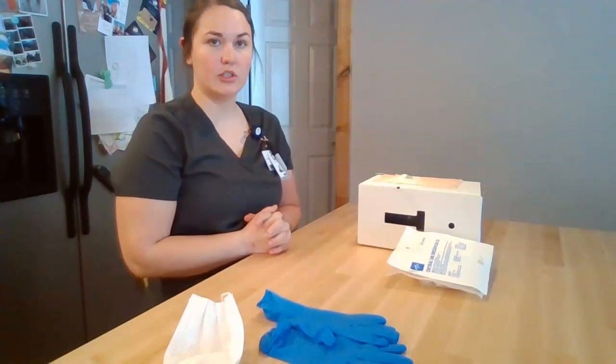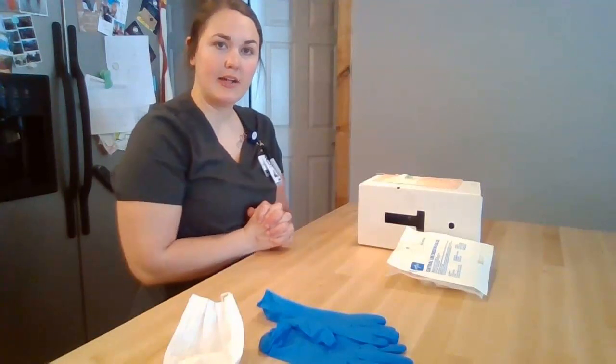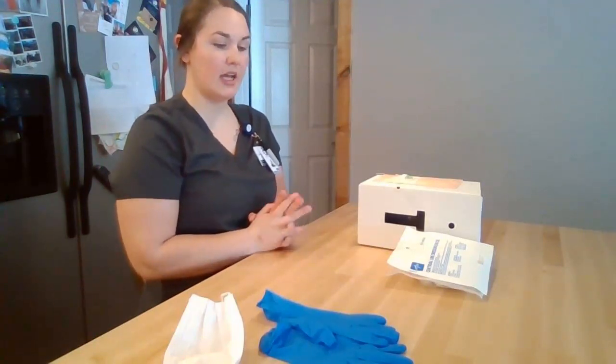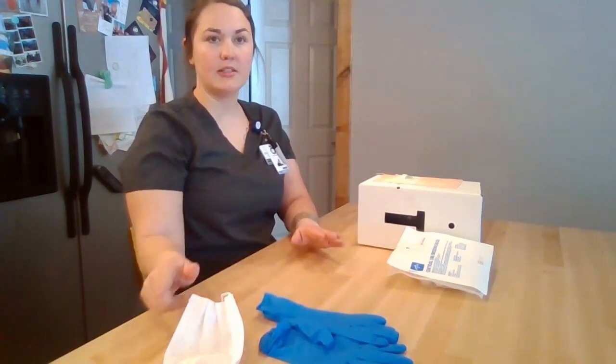I'm then going to shut the door and curtain to provide privacy and verify my patient using two patient identifiers. Once I've done that, I've brought in my dressing change material — my Central Line kit, some clean gloves, and a mask.